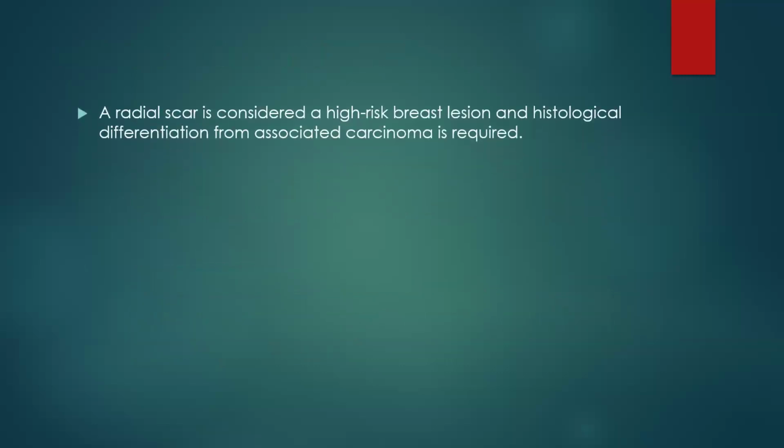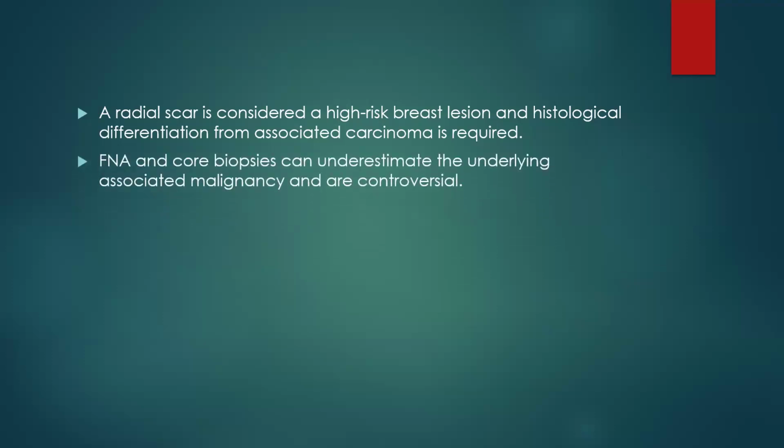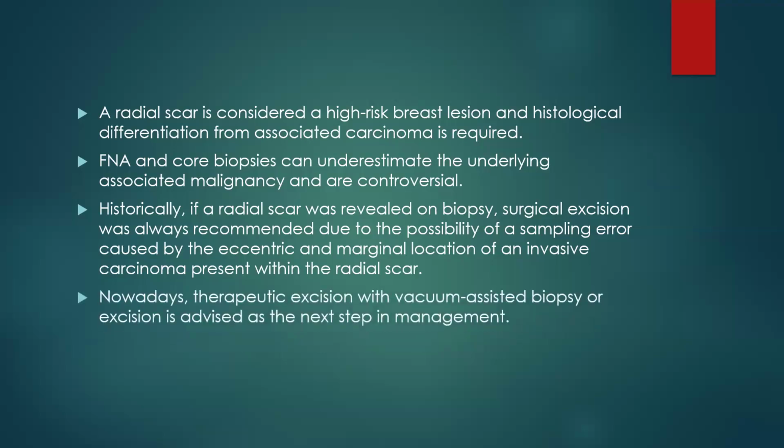A radial scar is considered a high-risk breast lesion, and histological differentiation from associated carcinoma is required. Fine needle aspiration and core biopsies can underestimate the underlying associated malignancy and are controversial in this case. Historically, if a radial scar was revealed on biopsy, surgical excision was always recommended due to the possibility of a sampling error caused by the eccentric and marginal location of an invasive cancer presenting within the radial scar. Nowadays, therapeutic excision with vacuum-assisted biopsy or excision is advised as the next step of management.